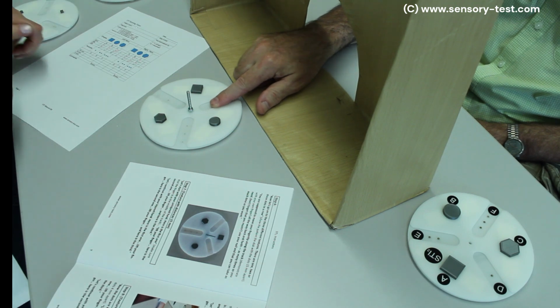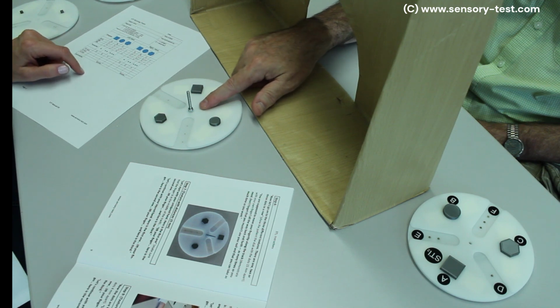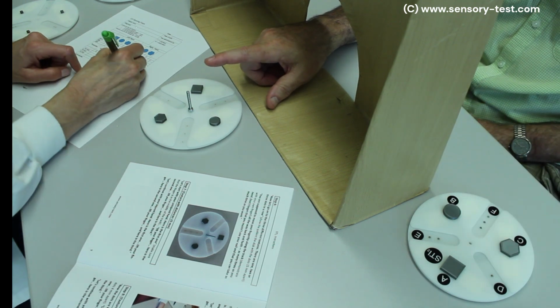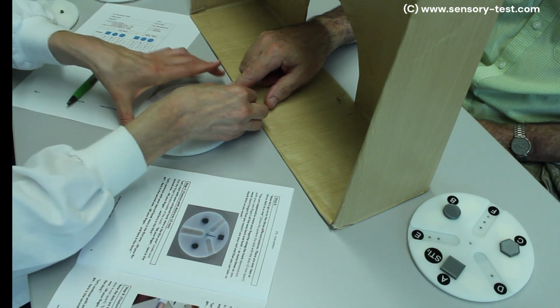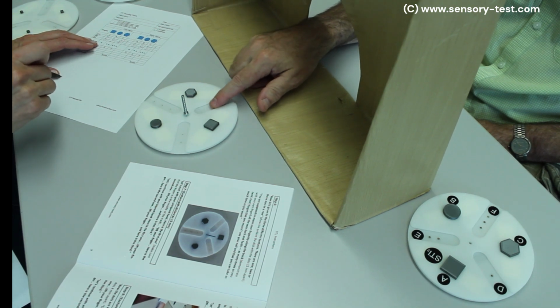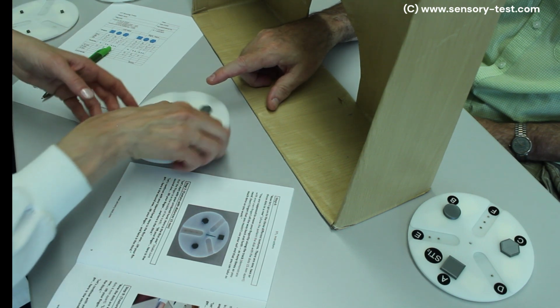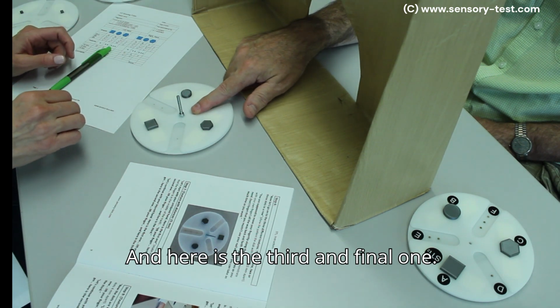Here is the first one. Here is the second one. And here is the third and final one.